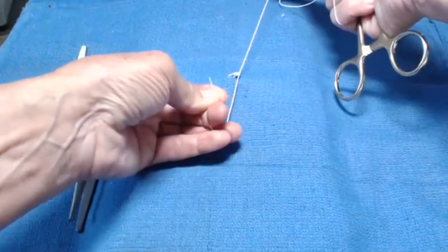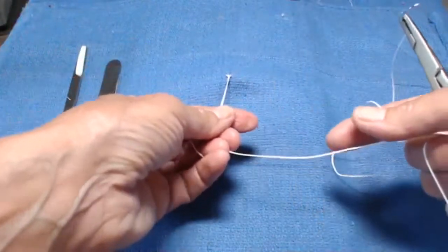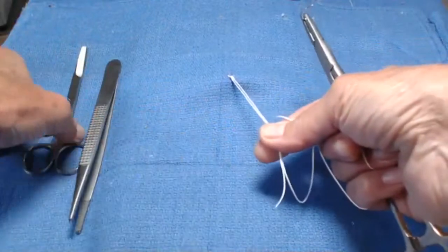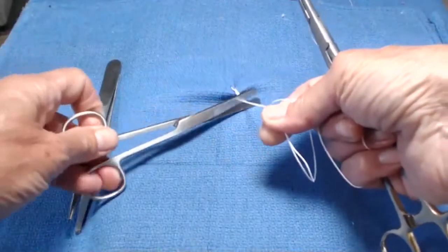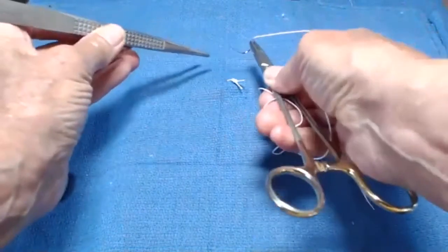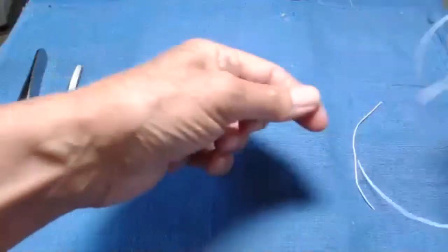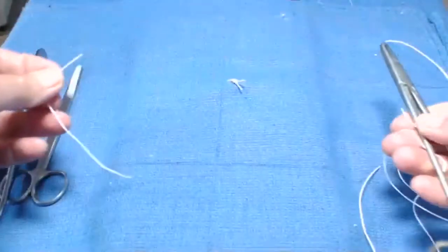All right, so that's four throws or two knots. Now at this point I can grab these, pick up my scissors with my left hand, and cut the suture. So this is more efficient because now I'm ready to just go make my next stitch, and I haven't put my needle holder down, and I can protect my needle or not — that is your choice.